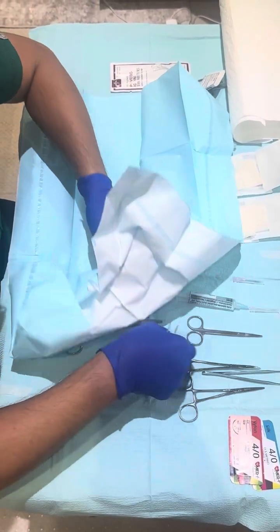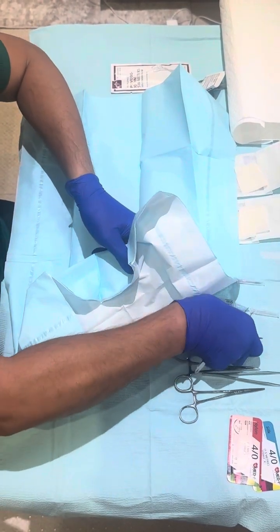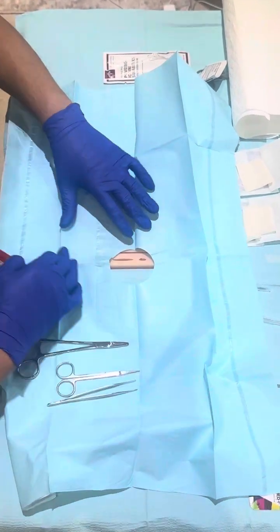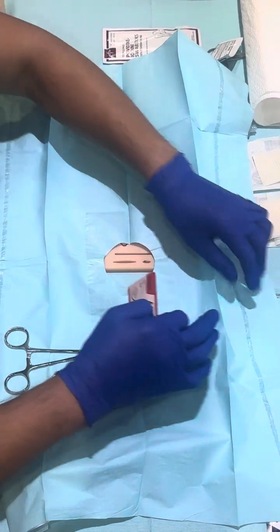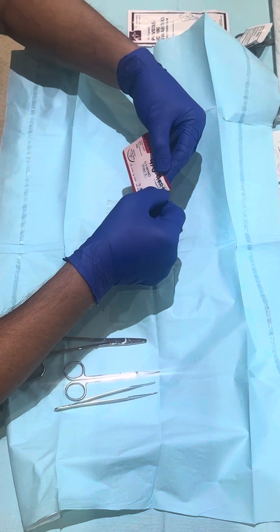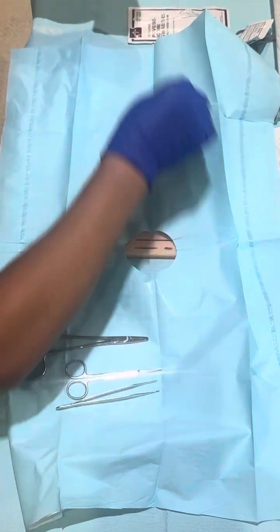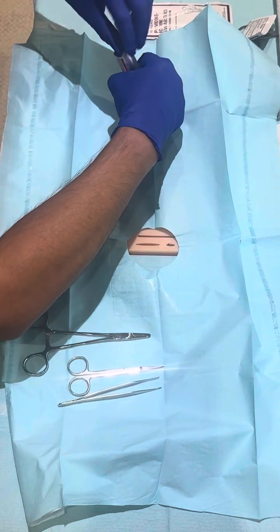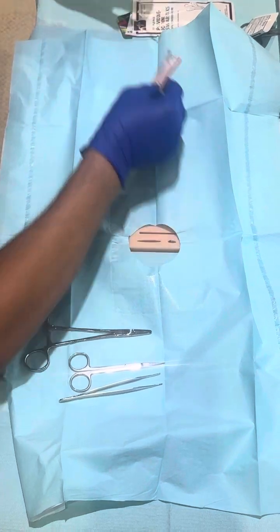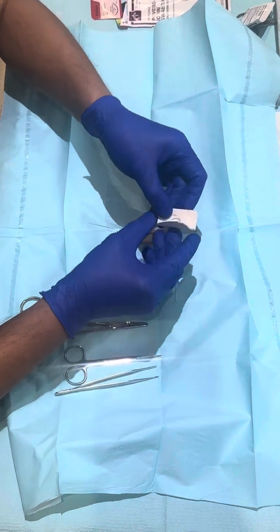Let me bring out all the equipment I'm going to use for this procedure. And using your nylon suture, your Prolene suture, usually your MA will give it to you, or sometimes you prep it already using a sterile technique when dropping off all these supplies, including the suture.